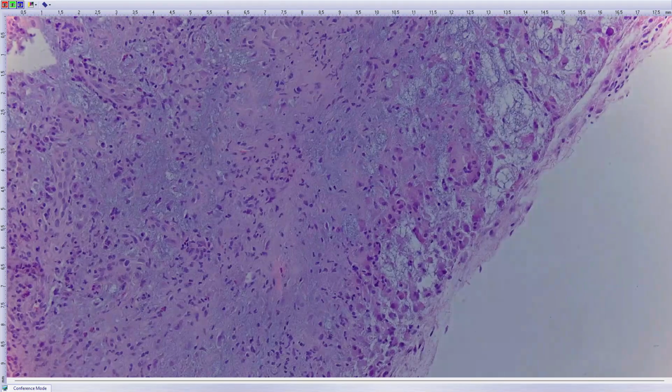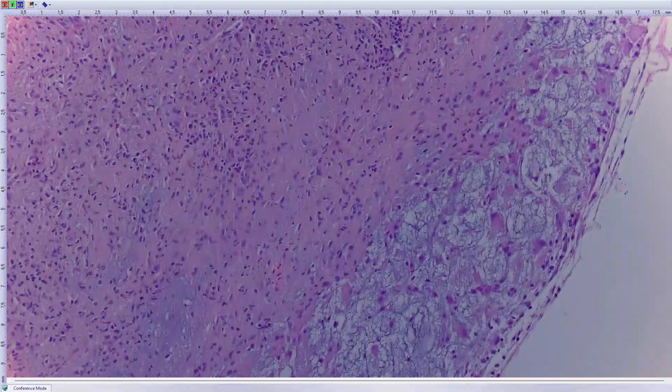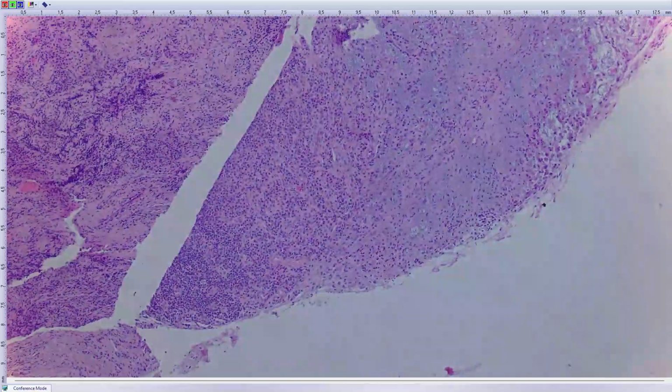So this combination of features, the inflammatory infiltrate, these RS-like cells with prominent nucleoli, these myxoid areas with mucin inside of the cells, together form a picture of so-called myxoinflammatory fibroblastic sarcoma, a tumor described 26 years ago by 3 different groups. One of them was my father. It was routine biopsies? No, it was consultation. It's not from recent time.